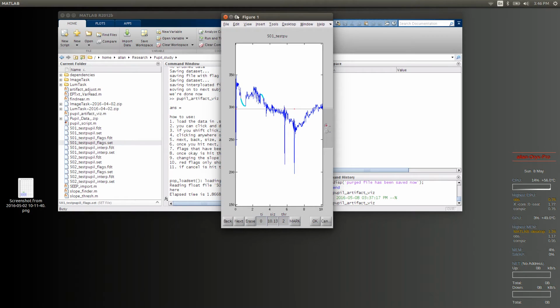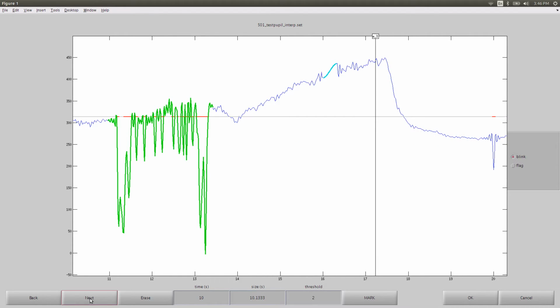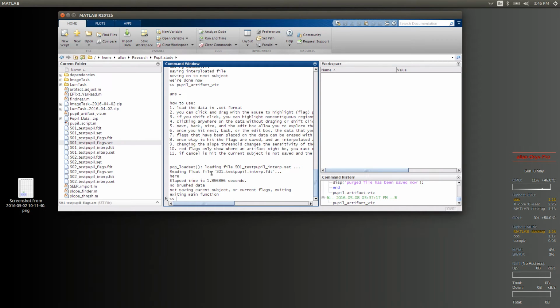Okay, so this is great. Remember, we grabbed those two blinks at the beginning, right? So we have those, and then in the next window we have a section of time that hasn't been removed yet. That gets done in a later step, but there's also a blink here on the right that we got. So you can still see that the marks we made are still stored. Okay, let me just cancel out of this because I don't want to do anything with it.